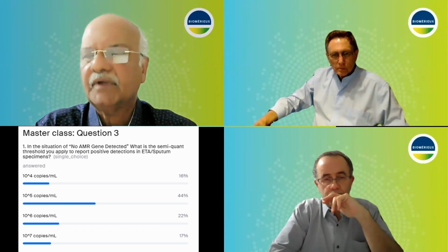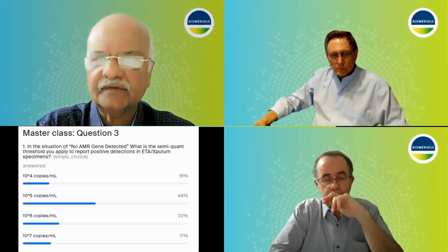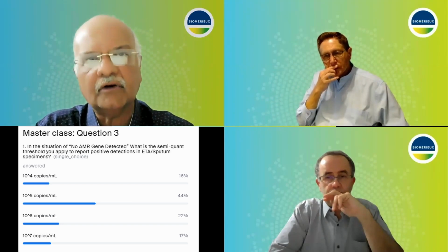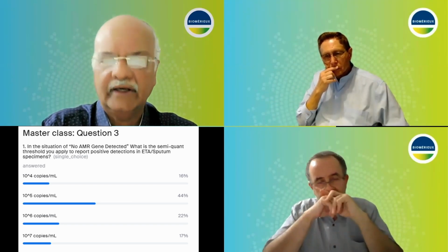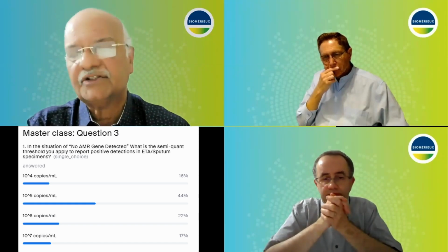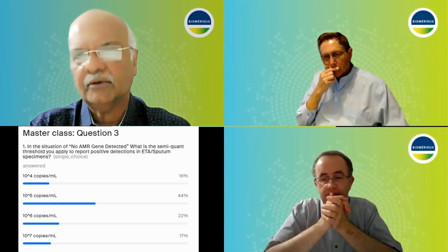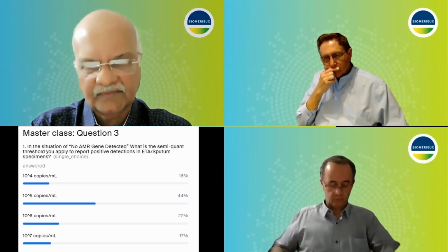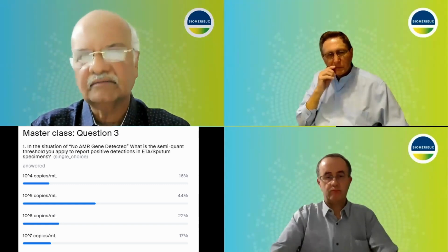So obviously the test can't pick them up. So if somebody finds Acinetobacter there in India, then one has to think of these as well. So in order to fashion treatment for that Acinetobacter, one will have to think of all these resistance mechanisms which it is known to possess and which may not be present in the panel.